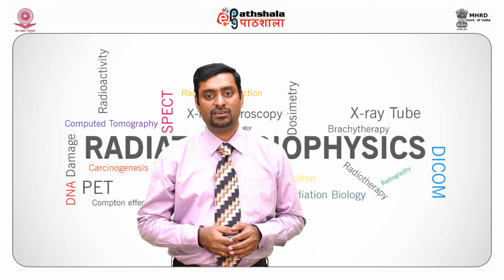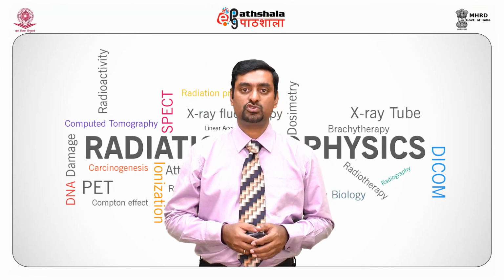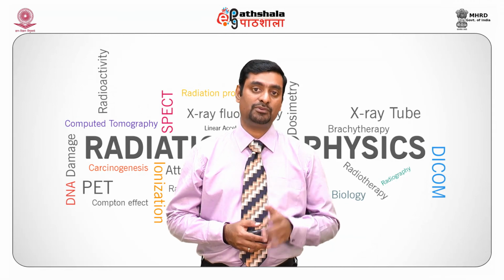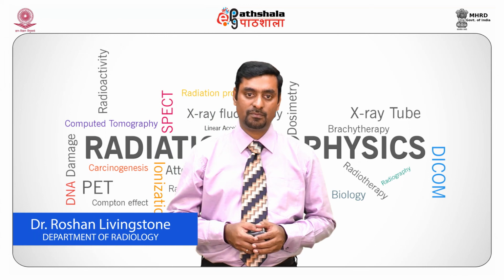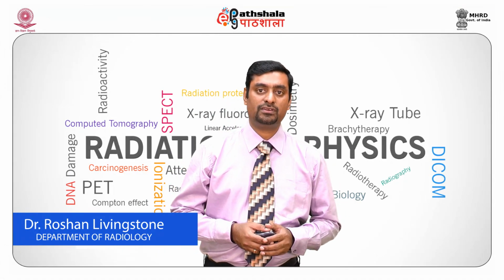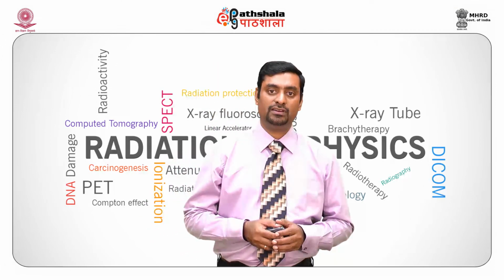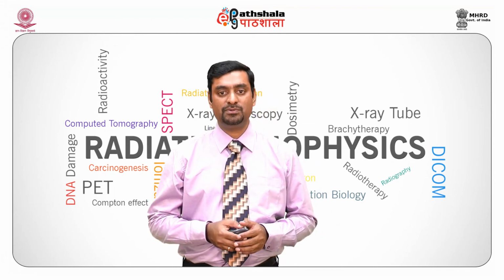Fluorescence is a principle where certain materials emit light, that is visible light, in response to X-rays, and the emitted light stops as soon as the stimulus is stopped. Dark adaptation is required while visualizing images in the conventional fluoroscopy system. Image intensifier instead of the conventional fluoroscopic machine: here we have an image intensifier which converts incident X-rays into a minified visible light image and amplifies the image brightness for better visibility to the viewer.